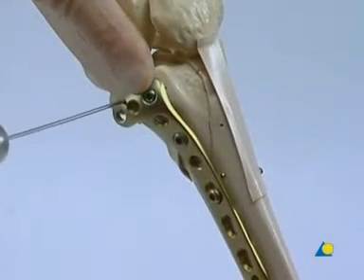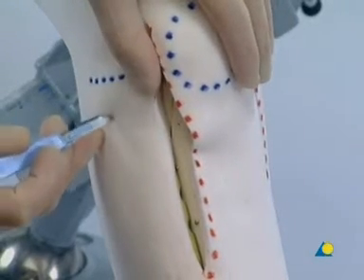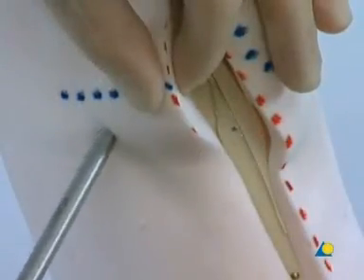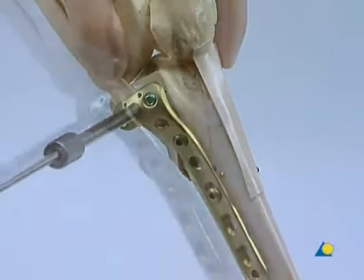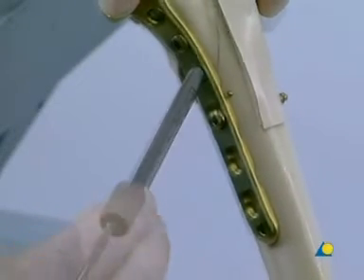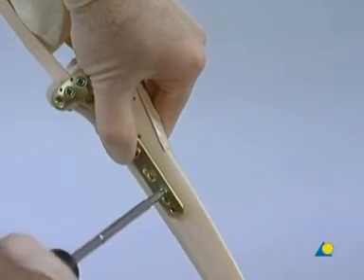The posterior K-wire is removed. The more posterior plate holes in the L-plate are usually hard to reach through the anterior incision, so a separate stab incision is appropriate. A second locking head screw is inserted through the middle plate hole of the proximal end of the plate in a similar manner to the first. The proximal fixation is completed by using a locking head screw just proximal to the apex of the fracture. Finally, another locking head screw is inserted through the most distal plate hole.